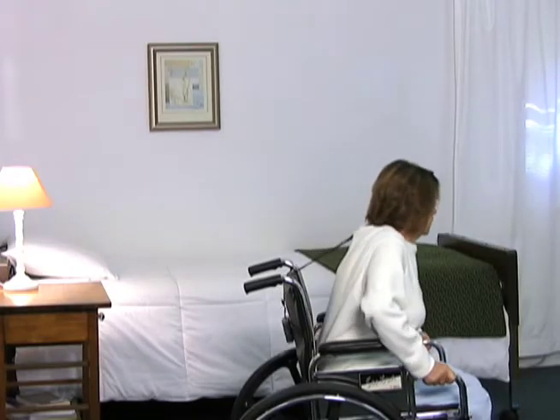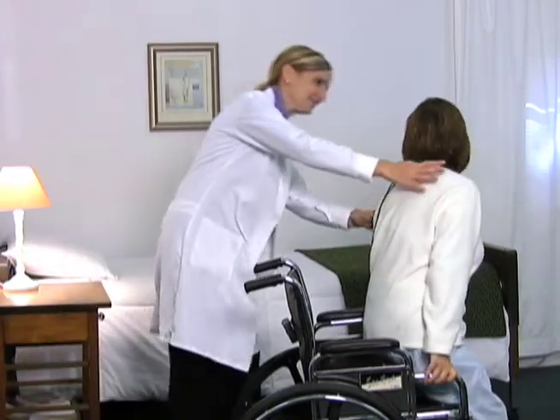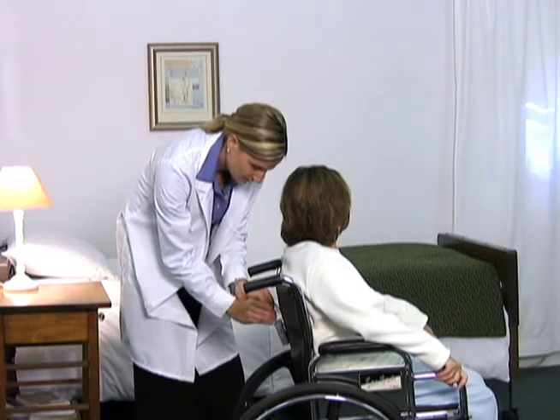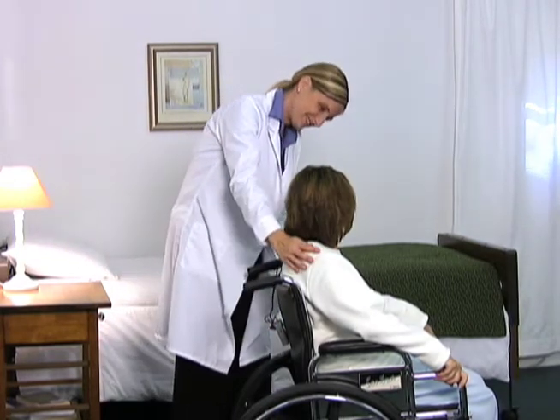When a patient attempts to leave the bed or chair, the pin is pulled from the alarm, sounding the 85 or 100 decibel alarm that alerts the caregiver to the fall risk patient.